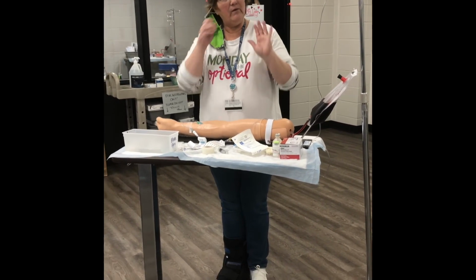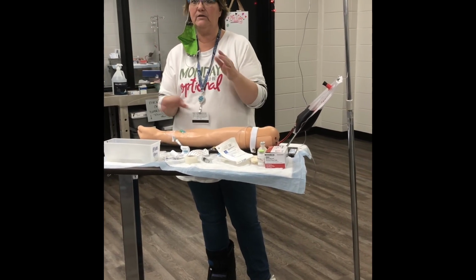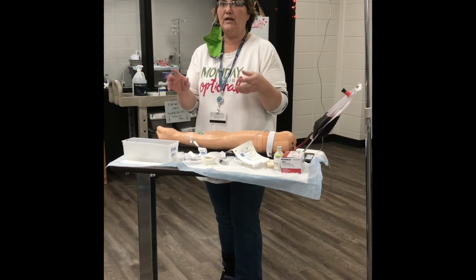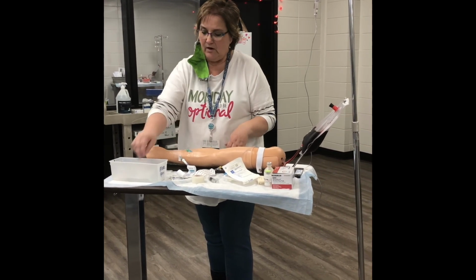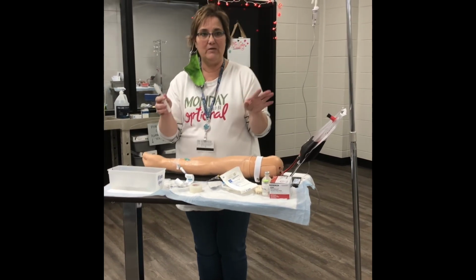All right, so now the doctor says stop the fluid but leave the IV line in. So you come in, you need to put gloves on because you're going to be flushing this site into an IV line, and anytime you fool with an IV line, we wear gloves because there's a chance that blood could back up and get on you. So all you need is a flush. I'm going to use the same one, and it's been contaminated, but you would not use one that's been contaminated.